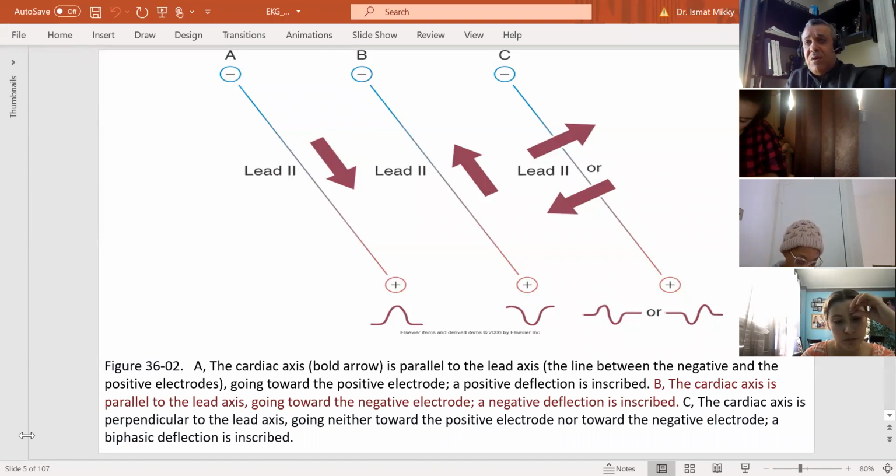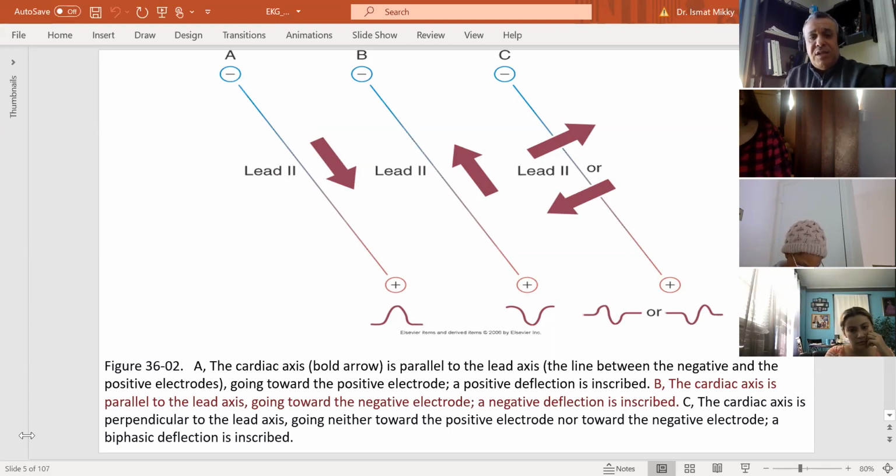A specialist sits and watches all of these monitors, and in case of any unusual or threatening dysrhythmia, the alarm will go off, and the specialist will intervene. The monitors run automatically when there is a life-threatening dysrhythmia: the alarm goes off, and at the same time the printer starts printing the dysrhythmia, so that the technician watching these monitors can take action and respond accordingly to the changes on the EKG tracings.